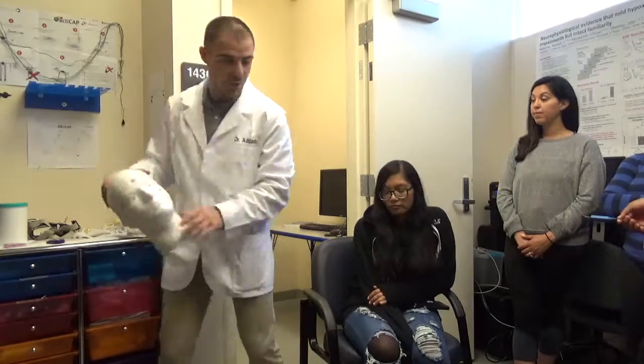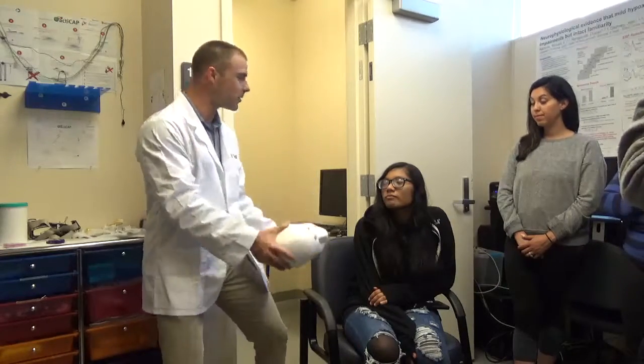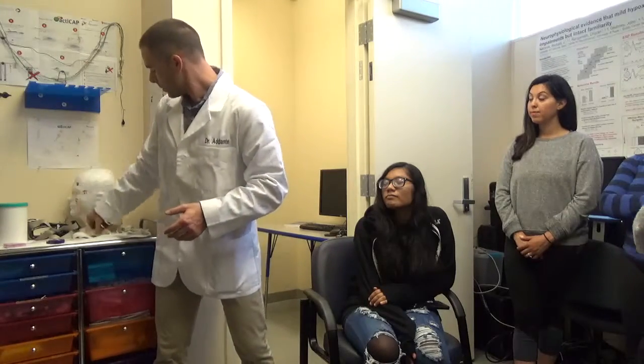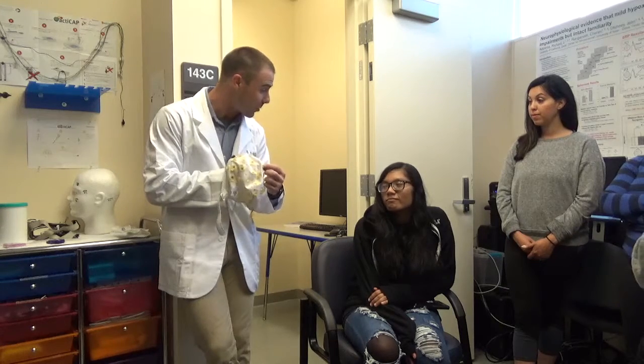This is a long explanation for you guys. It wouldn't be this long for our research participant, because we're killing multiple birds with one stone here, explaining it to her and to you guys. We have to explain to her that the brain signals have a heck of a journey to make from inside your brain to the outside of it, and then to get picked up on the top of this plastic thing after it goes through this gap.